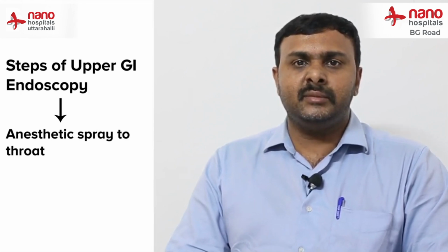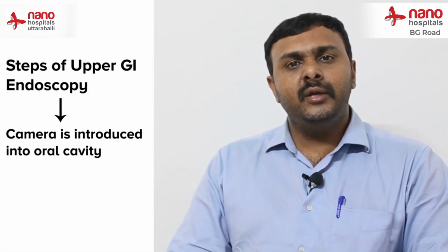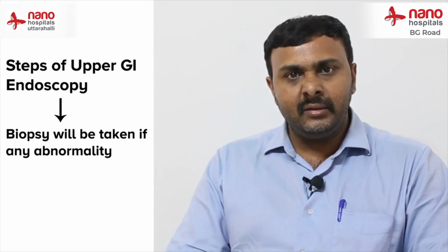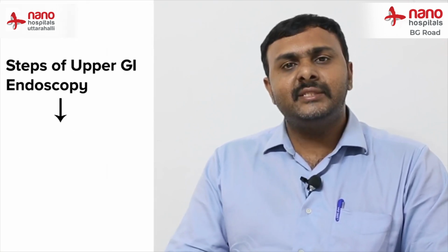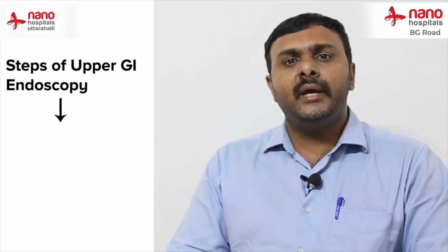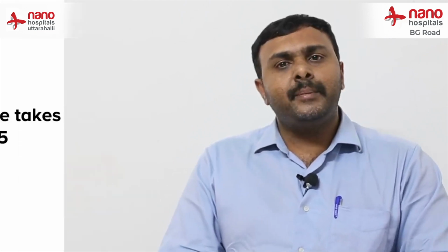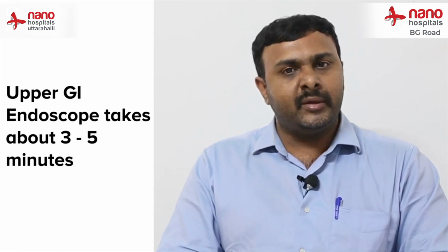So during endoscopy, what should the patient expect? During an upper GI endoscopy, there could be a mild amount of discomfort. Initially, the endoscopist will give you an anesthetic spray to your throat and then the camera is introduced into the oral cavity. The endoscopist will ask you to swallow the scope and the scope will go inside. If some abnormality is found inside the GI tract, then a biopsy could be taken, to take a sample of the problematic area and send it to the lab for testing. If there is no problem, the endoscopist will take a couple of photos and the camera is brought out. The entire procedure for the upper GI endoscopy will take about 3 to 5 minutes and it is relatively comfortable after the endoscopy is done.